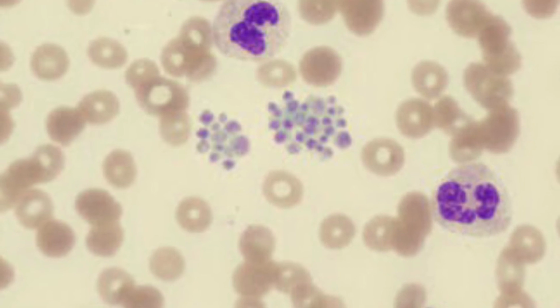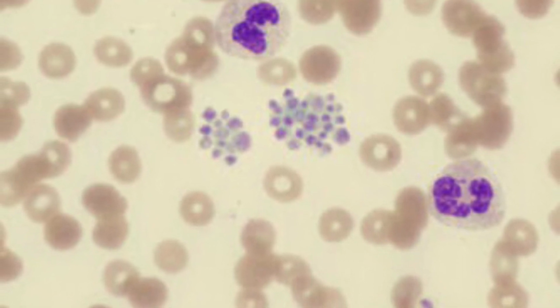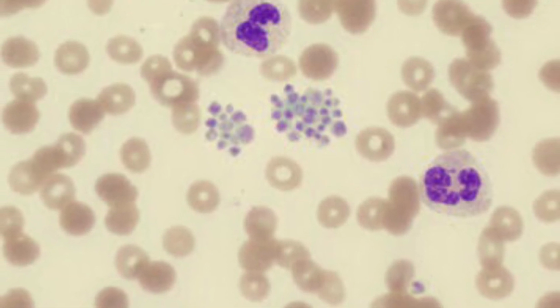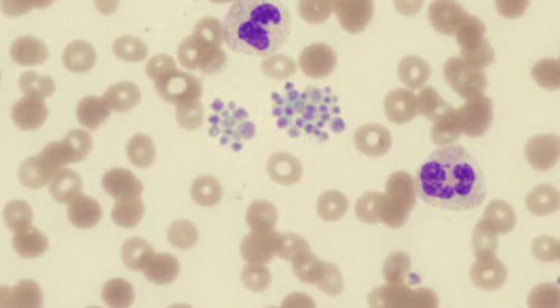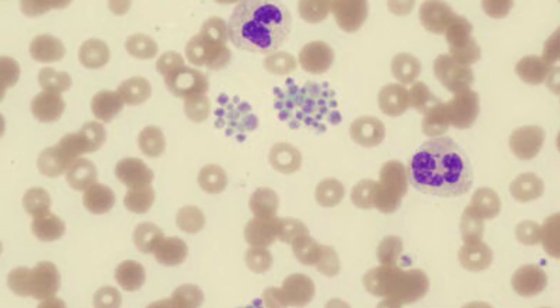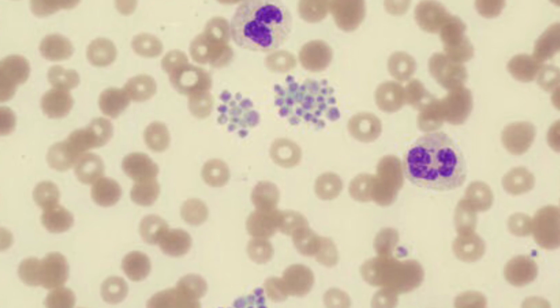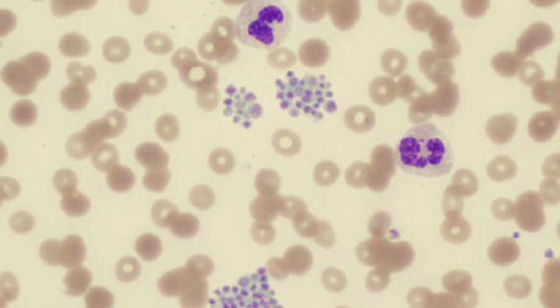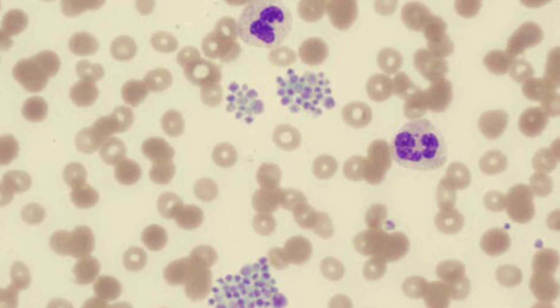Failure in recognizing pseudothrombocytopenia may lead to unnecessary diagnostic tests, incurring costs to the patient, and unnecessary treatment, leading to patient mismanagement. In such cases, the test has to be verified using citrated blood, wherein, if there is still platelet satellitism or clumping, recollection of EDTA and citrated sample from the patient is advised.